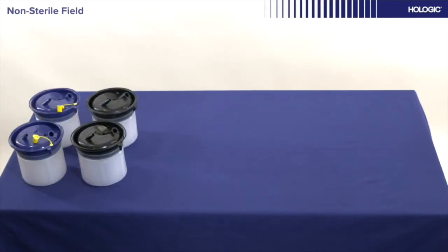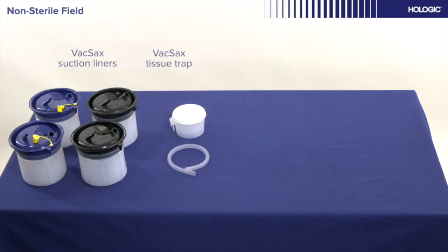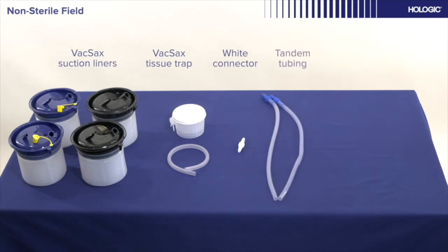The following consumable items are required for the procedure in the non-sterile field: two VacSax suction liners blue, two VacSax suction liners black, VacSax tissue trap, white connector, two VacSax tandem tubing, and a bag of saline, preferably 3 litres.